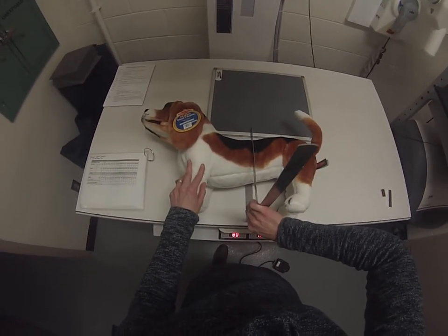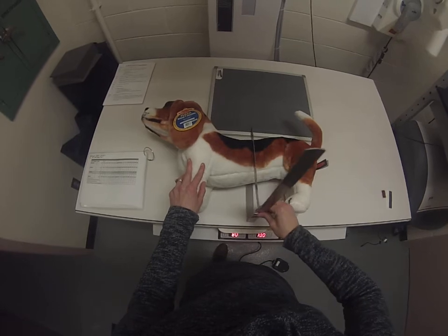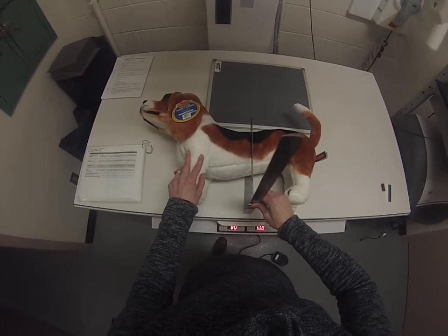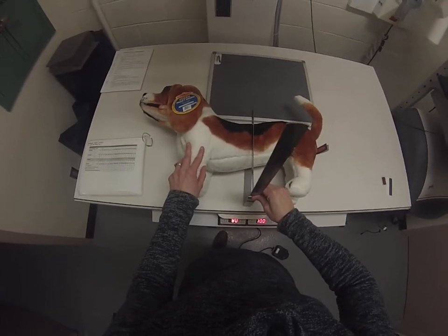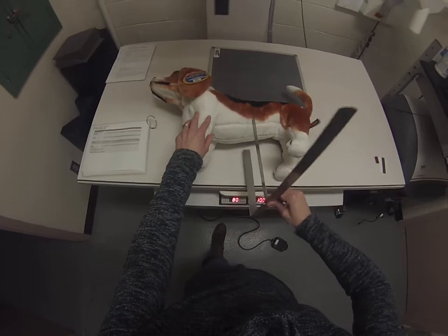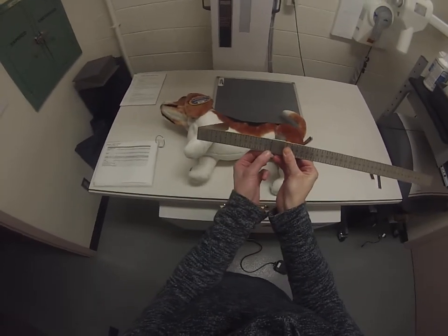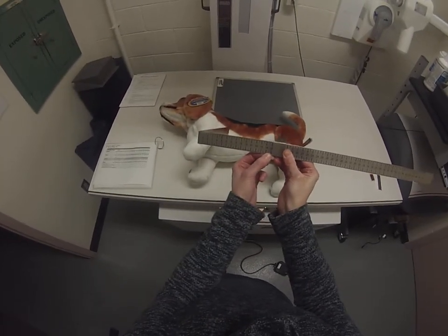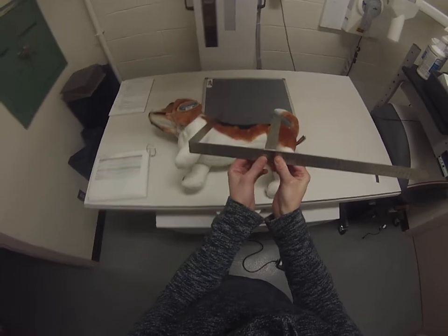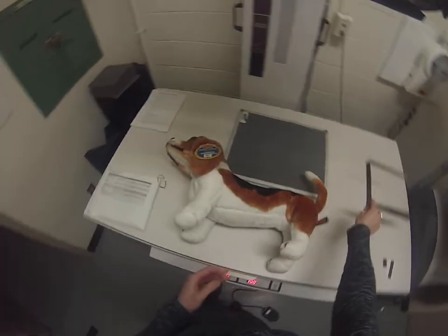For an abdominal view, we typically measure right behind the rib cage or close to it. I have my measurement — I slide out my calipers and I see that we're just at about 15 centimeters. So that is my measurement.